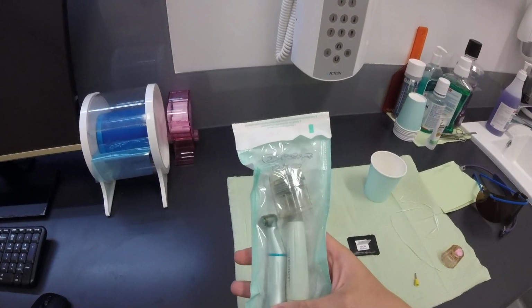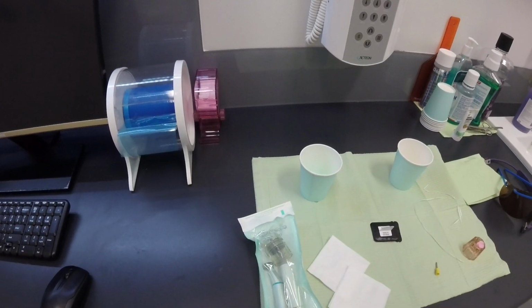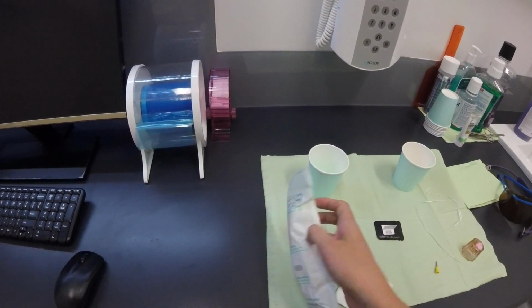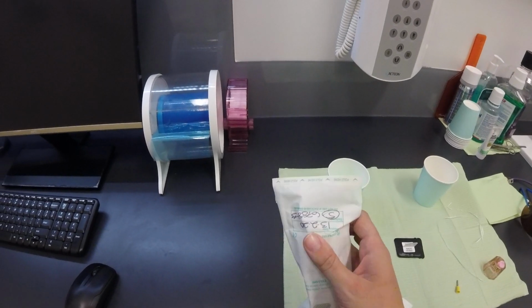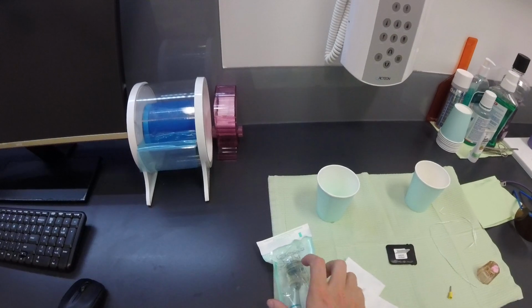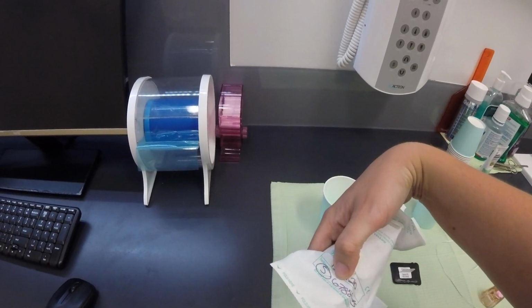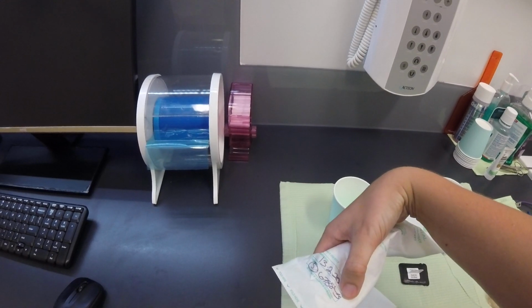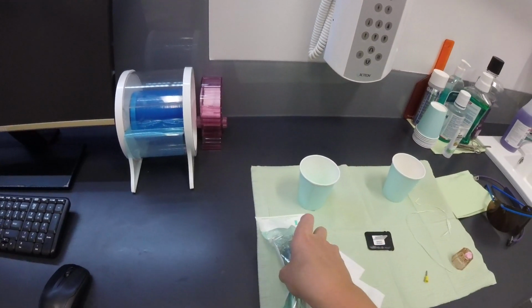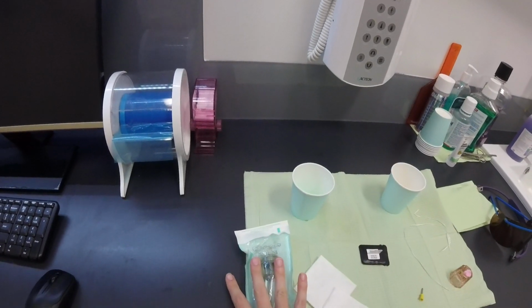So this is one of our clean packs. Everything is bagged at this practice. We take it out, we add a batch code. This is just a demo mode. We actually have a scanning system now. But this tells you the date it was processed, the load, and the batch number, also who loaded it. There's an initial. But as I say, our new system has a scanning code. So this is just to show you.